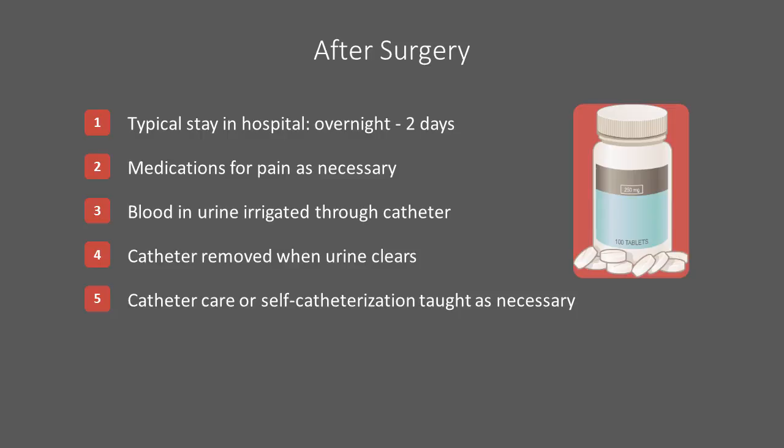If this is the case, your doctor or nurse will teach you how to care for the catheter yourself. In other cases, patients are taught to catheterize themselves intermittently to empty the bladder. Separate modules are available that detail catheter care and intermittent catheterization.